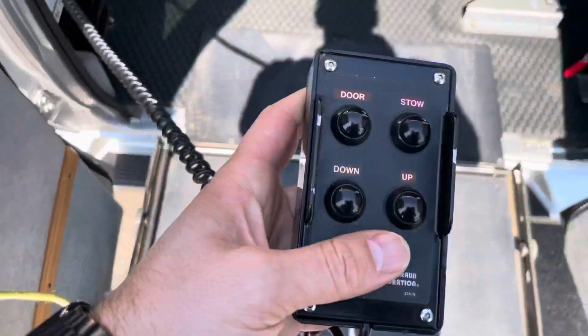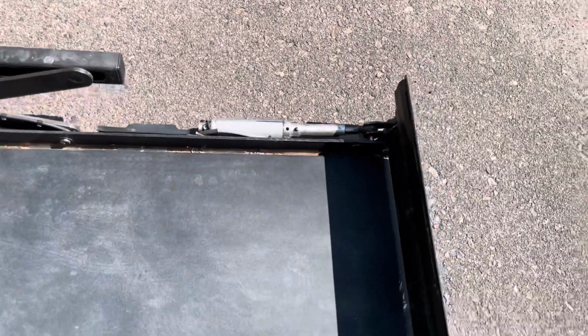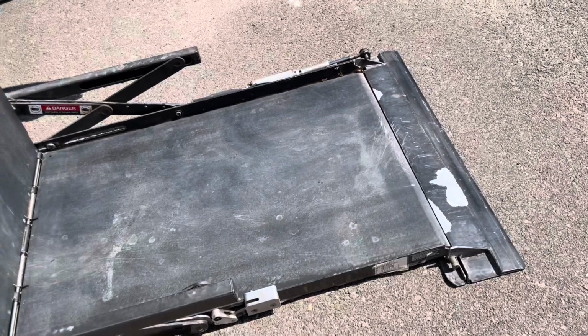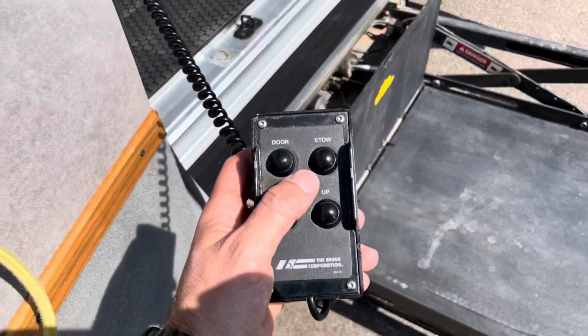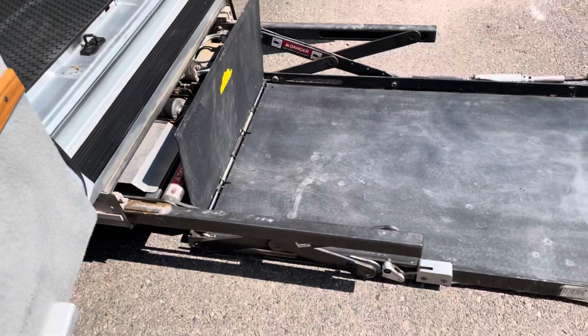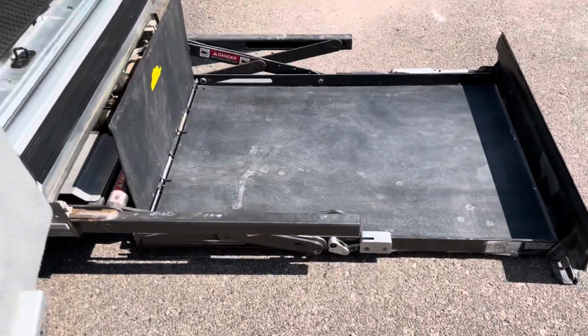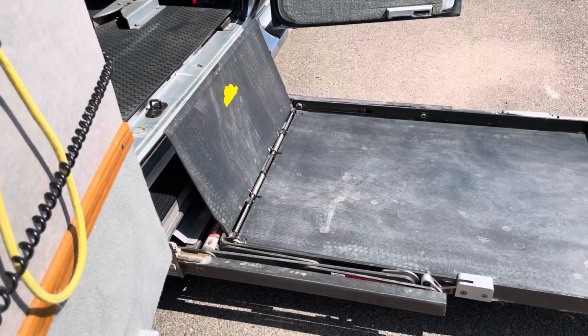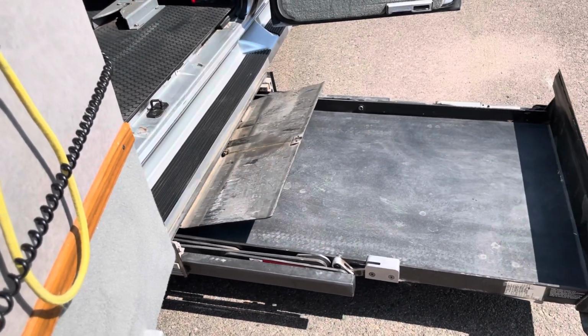And then to exit the vehicle, we come back out the lift here. We just simply hit down. It's going to bring us all the way down here. That lift catch slides open, and then to store the lift, all you have to hit is stow right there. So that's going to allow the system to close everything up, and then it'll find the right position to be able to stow that right back inside there.